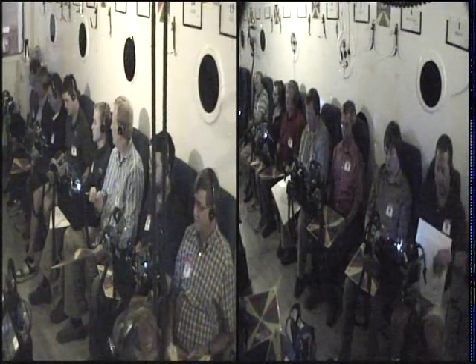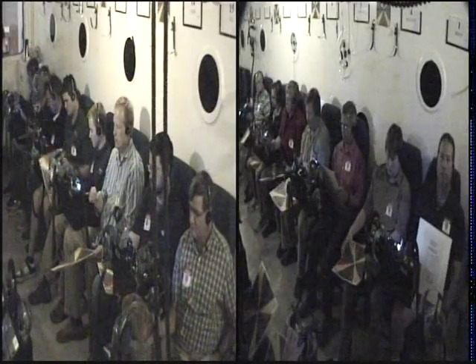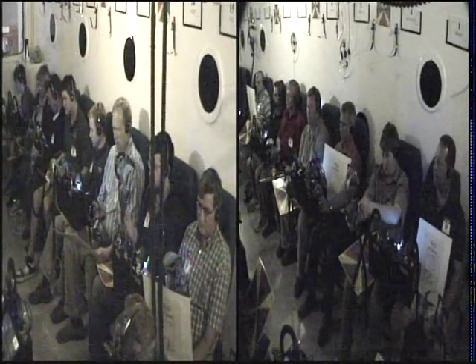All right, go ahead and get the card ready. Grab the mask, but don't don it just yet. Here in about 15 seconds, I'm going to have you correct by putting the mask on. Don't put it on just yet.